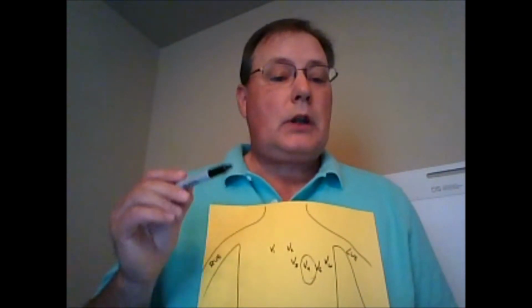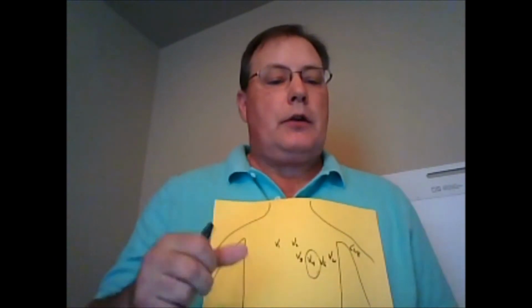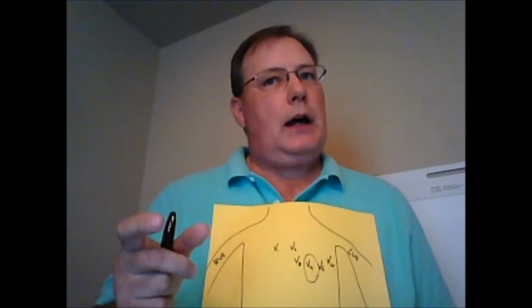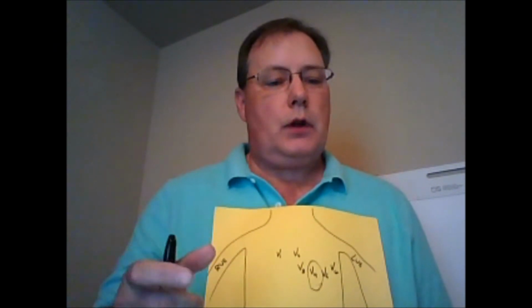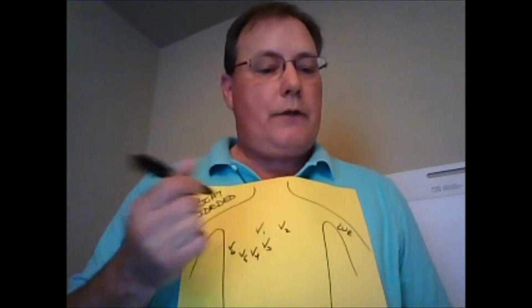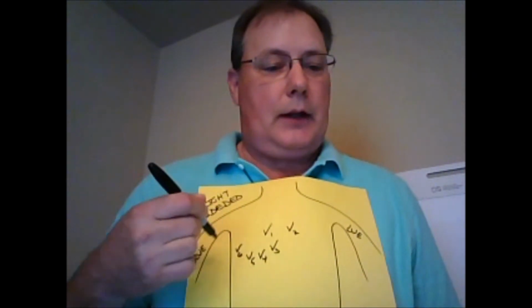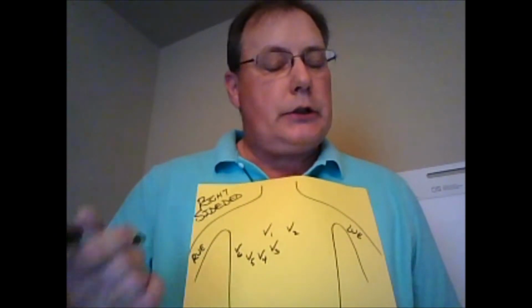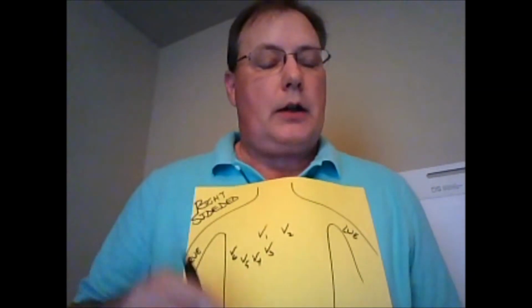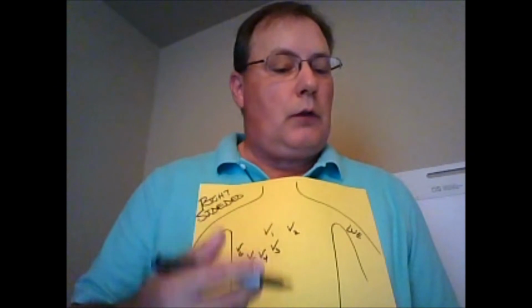Now, you've got this patient, they've had a sudden drop in blood pressure, they're diaphoretic, they look like crap, and you're thinking, oh, was it V4, V5? I can't remember which one I'm supposed to move. So I think the easiest way to remember how to do a right-sided EKG is just to take your V leads. Now V1 and V2 can stay the same. You don't have to move V1 and V2. But you take V3, V4, V5, V6, you move them to the right side, do your EKG just like you would normally, and just make sure that you write on it that it's a right-sided EKG. And that is it. That is all there is to doing a right-sided EKG.